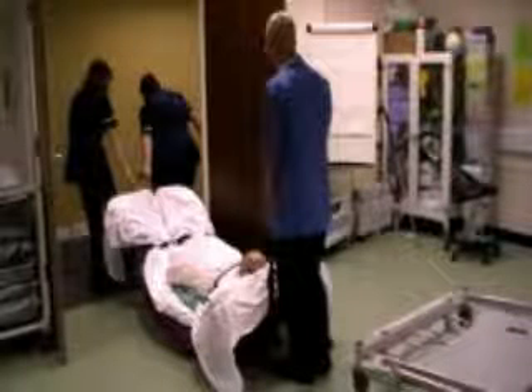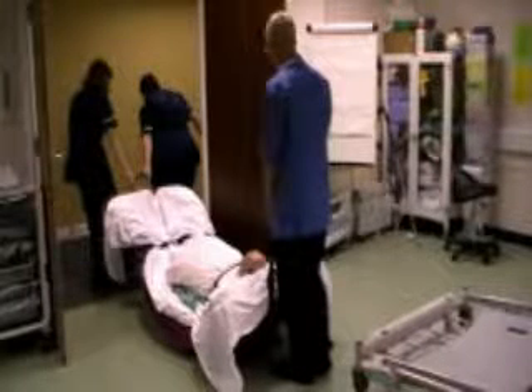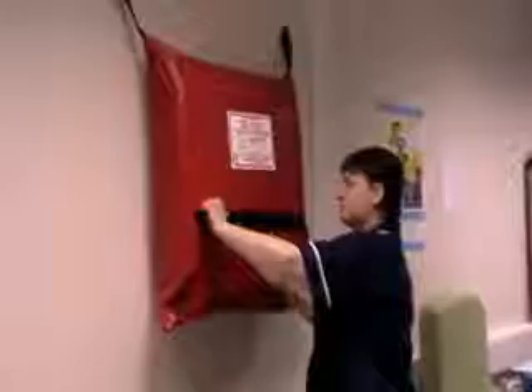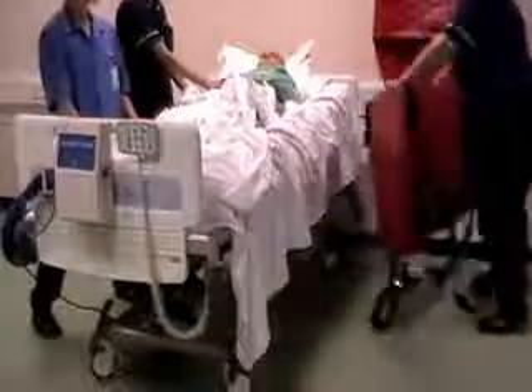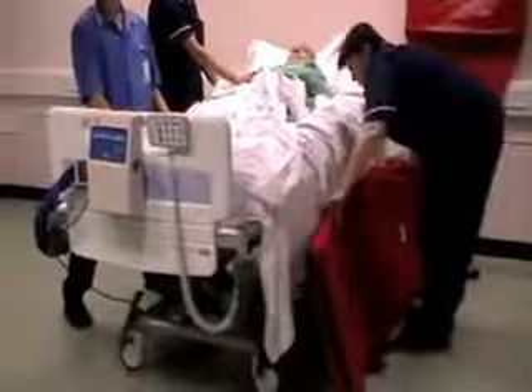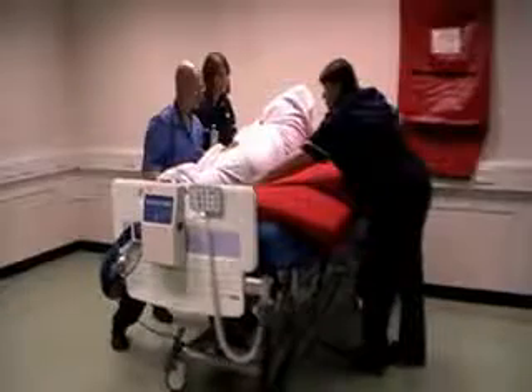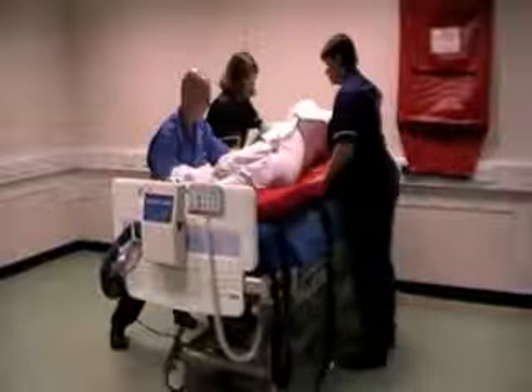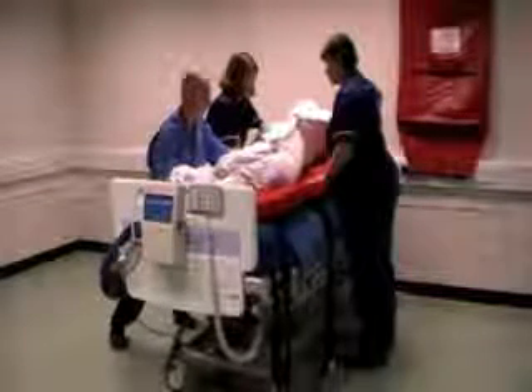When passing through doors, ensure feet go first. For the vertical evacuation of highly dependent patients who are on dynamic mattresses, now let us turn to the ski pad. But first, move the patient on their bed using the principles of progressive horizontal evacuation, moving towards a stairwell.